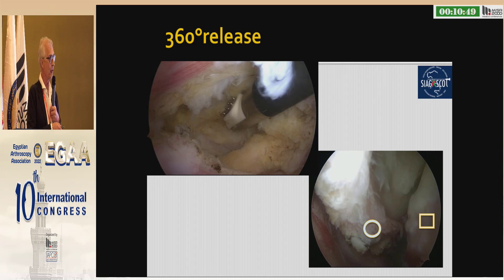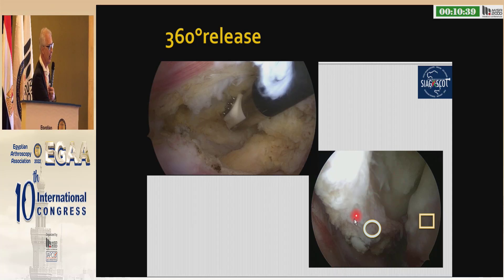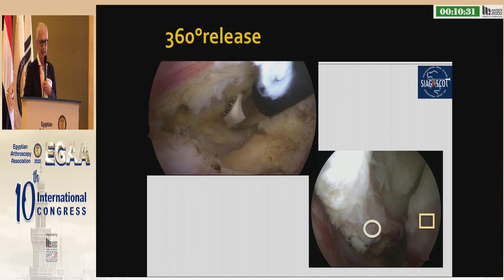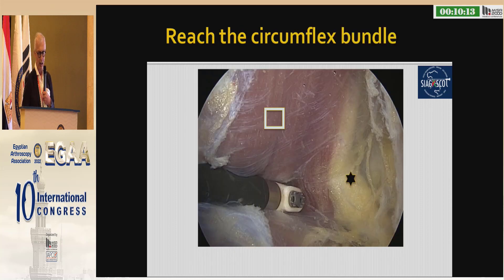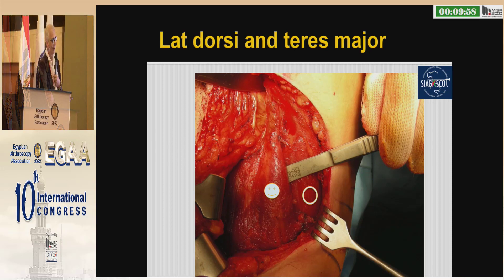Let me go to the arthroscopy. We have to release 360 degrees in order to have no restriction at the axilla and to have the humeral head gliding distally. Then we have to release backward the space between the deltoid and the inferior capsule. We can reach distally the circumflex bundle, which is the star, and then we can go on to release the muscle.